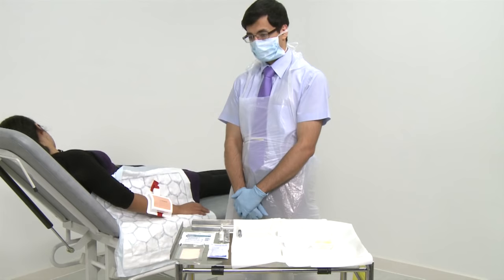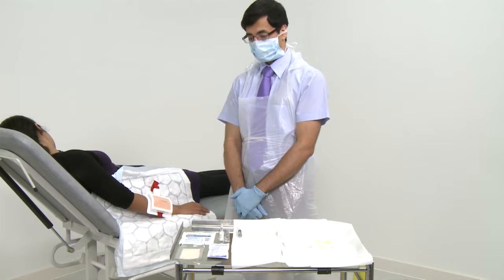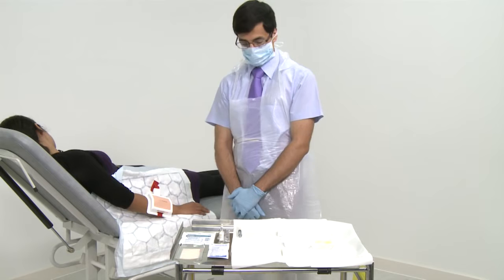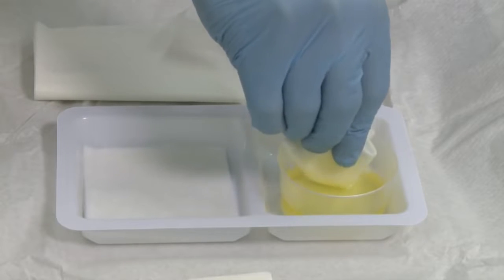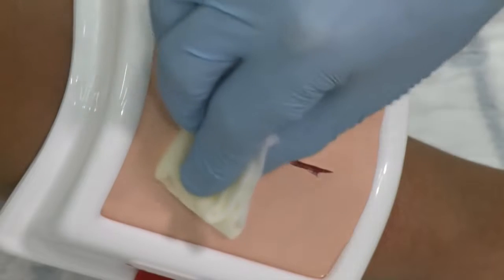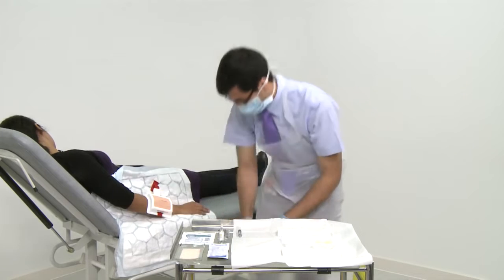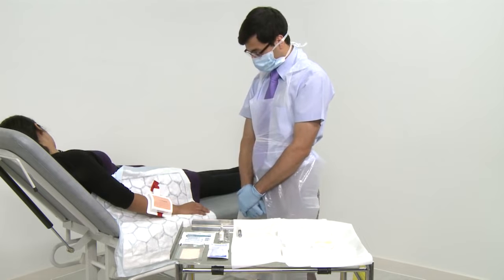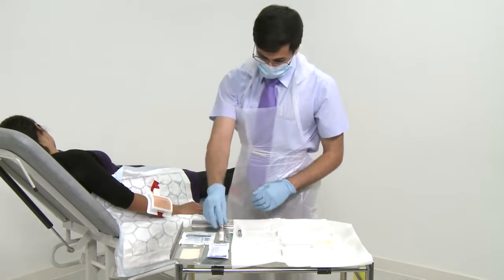In order to allow thorough exploration and cleaning of the wound, local anaesthetic may need to be injected around the wound. 1% lidocaine is most commonly used. The wound edge is first cleaned with an antiseptic solution. Allow the solution to dry, and trim any hair for at least 2cm around the wound to prevent interference with sutures. Check the expiration date of the local anaesthetic.